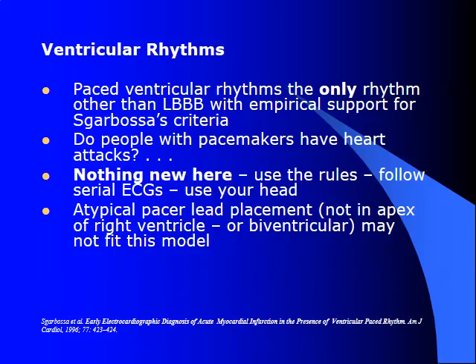Okay, so we'll talk about our ventricular rhythms now. Another common STEMI mimic. Paced ventricular rhythms are the only other rhythm with empirical support for Sgarbossa's criteria other than left bundle branch block. The question is, do people with pacemakers still have heart attacks? They do. You've got to follow your rules. You guys should know what a paced rhythm looks like.